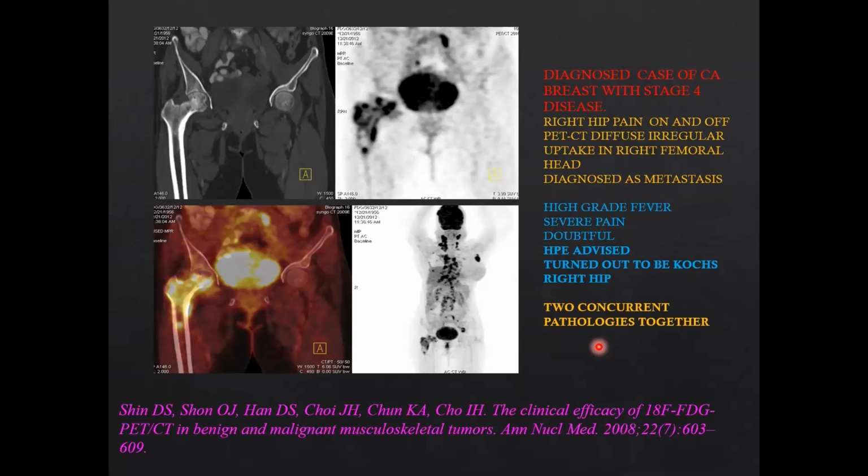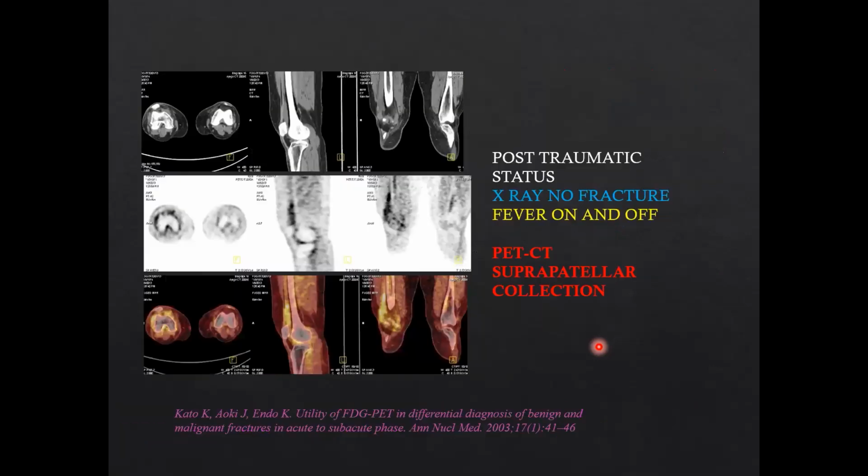This is a post-traumatic status, X-ray no fracture, fever on and off. So, this is some sort of focal area of uptake which is seen here. And if you see carefully, there is a suprapatellar effusion here, that is all. That is inflamed, that is probably infected.